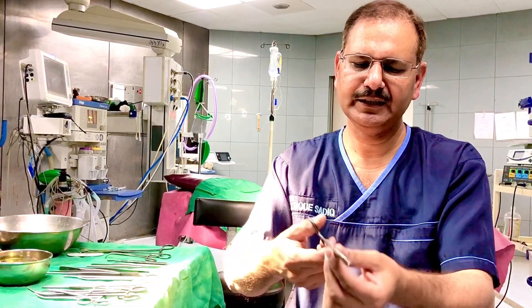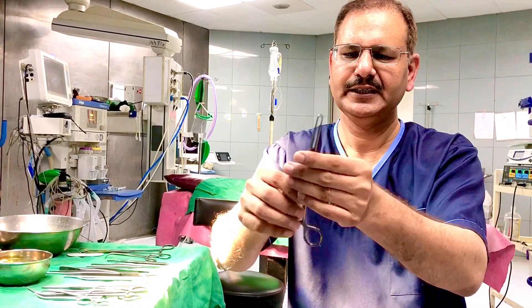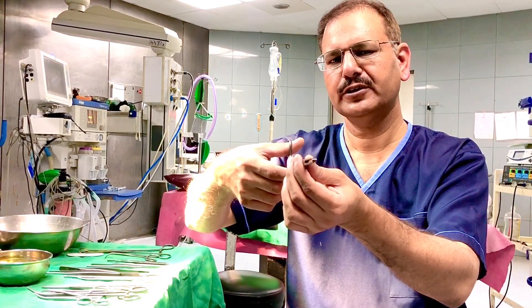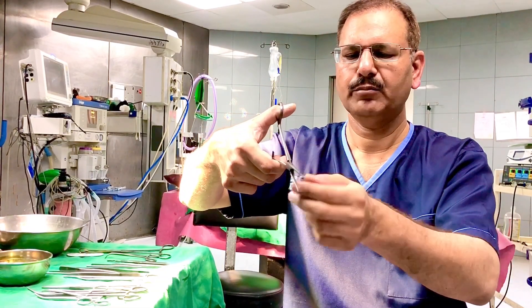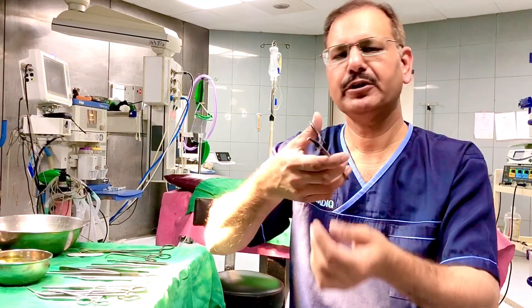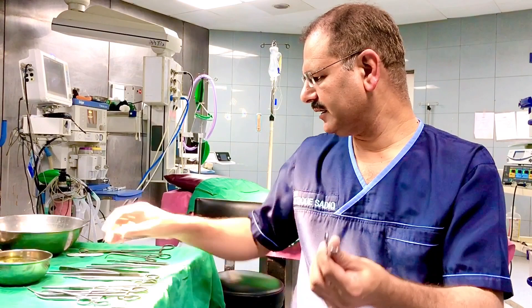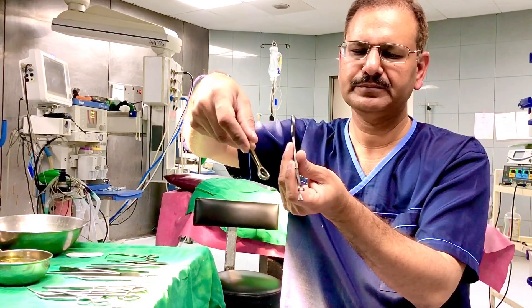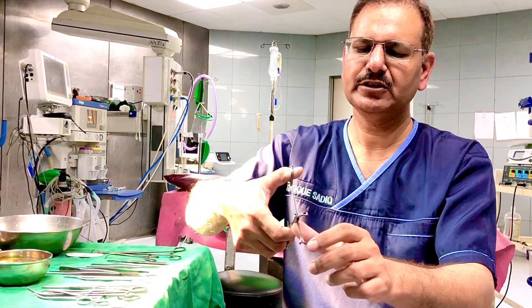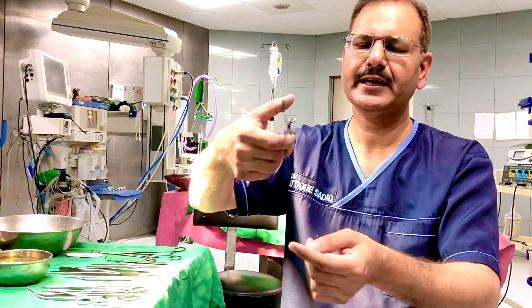This is another type of forceps — you can see it has multiple teeth. This is Allis forceps, used to hold tissues forcefully. You cannot hold delicate structures with these teeth, so Allis forceps is used to hold skin and aponeurotic sheets. This is sponge holding forceps. This is Babcock forceps, which is non-traumatic and can be used to hold bowel or tubular structures like the appendix, fallopian tubes, or ureter.